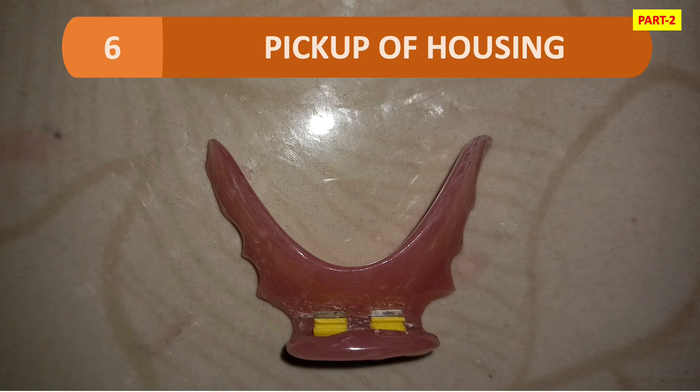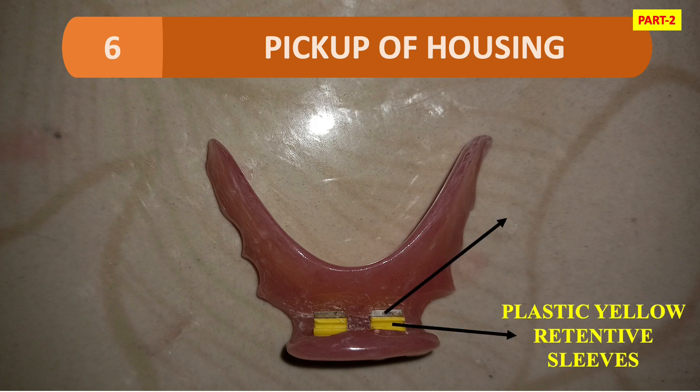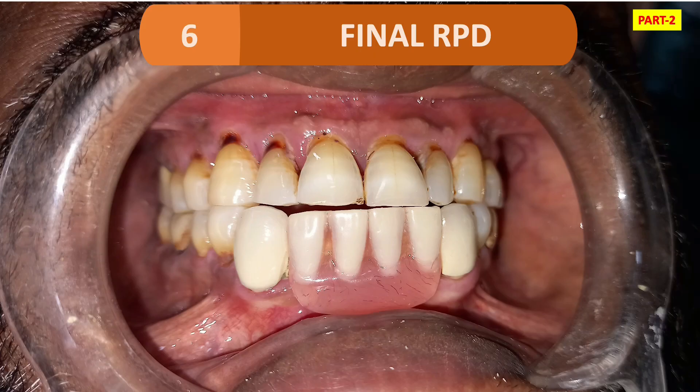The next step is the pickup of the housing. This is the image of the final removable prosthesis after pickup. As you can see, we have the plastic yellow retentive sleeves and the metal housing — under the metal housing the yellow retentive sleeves are placed. To pick up the housing, we attach the clip to the bar attachment and then pick up using self-cure acrylic resin into the RPD. With the self-cure acrylic resin, we pick up the sleeves or clip.